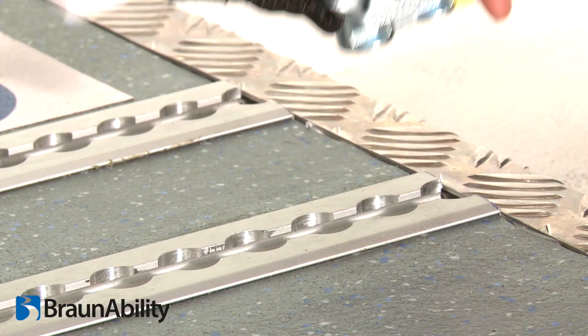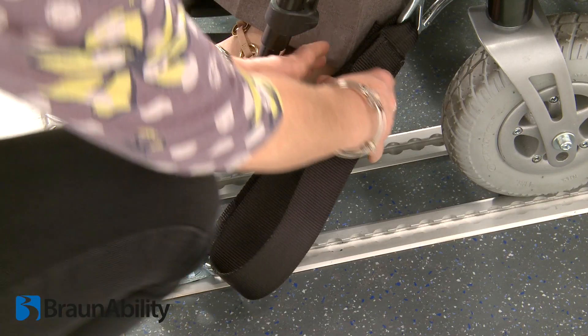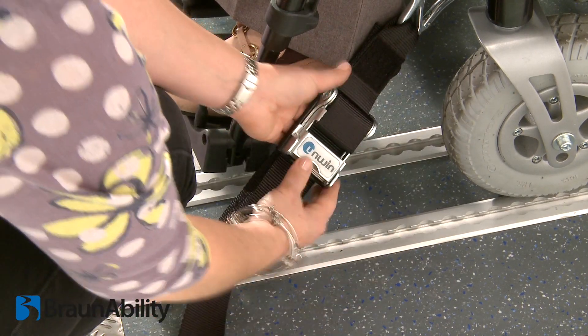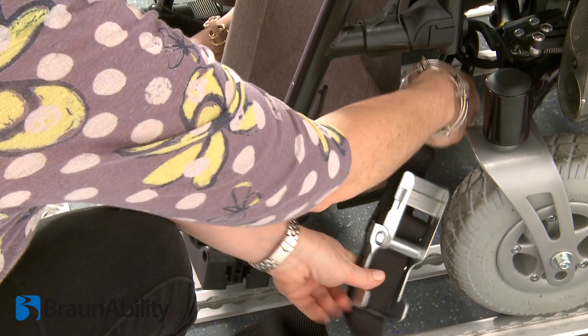Lift the yellow retaining clip fully and pull away from the wheelchair to remove the front straps from the rail. Repeat the procedure with the opposite tie-down and store safely.